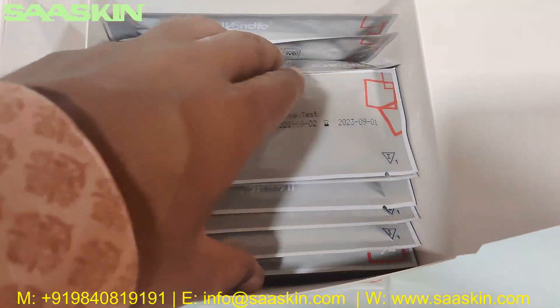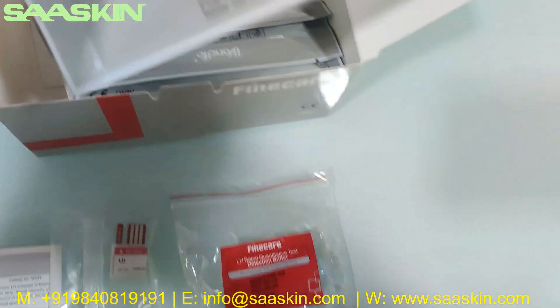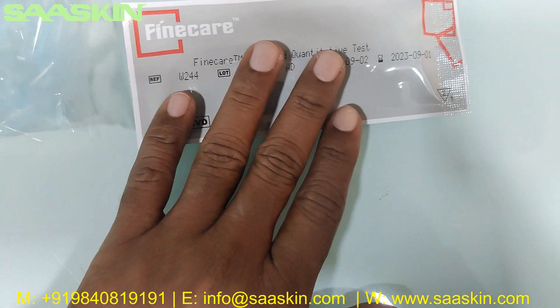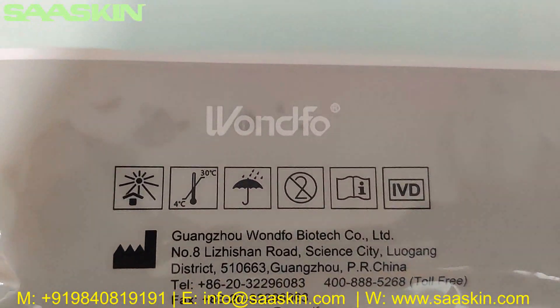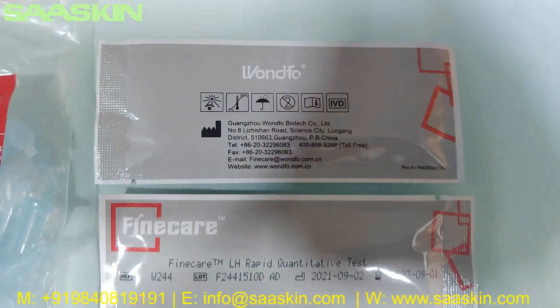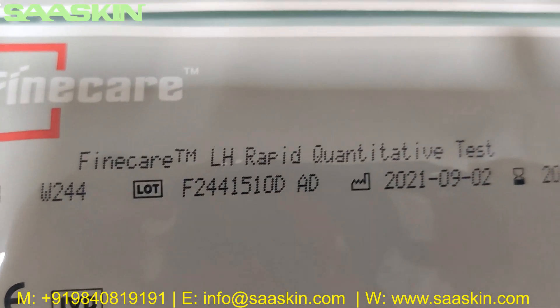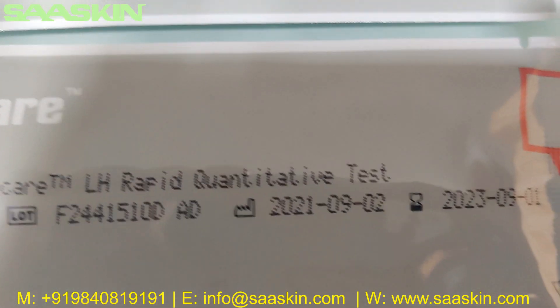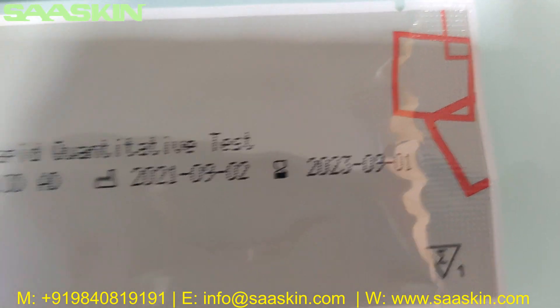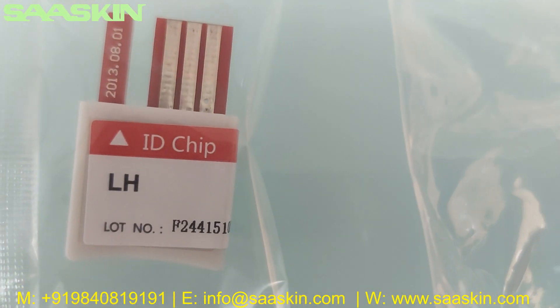Inside you can also see the test cassettes — there are 25 test cassettes. Here on the cassette you can see it is from Wondfo Finecare, made in China. The product label shows 'Finecare LH Rapid Quantitative Test' with the lot number and the manufacturing and expiry date. Notably, this lot number is the same as the lot number on the ID chip.